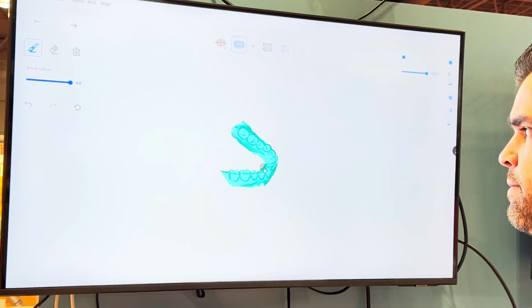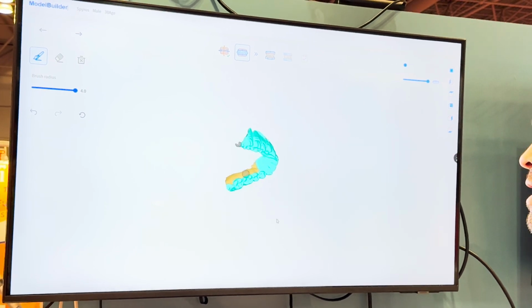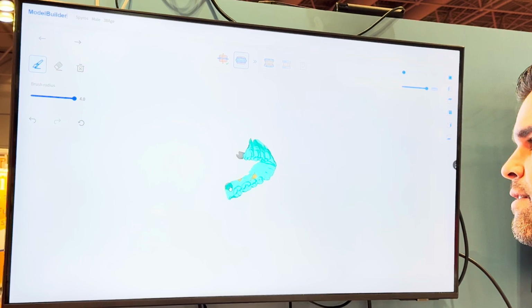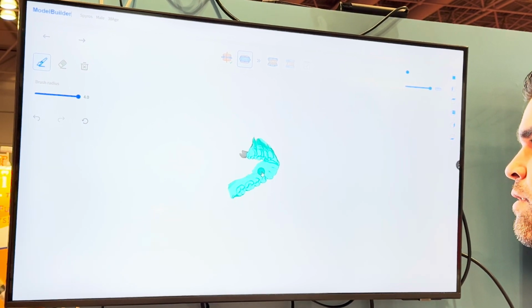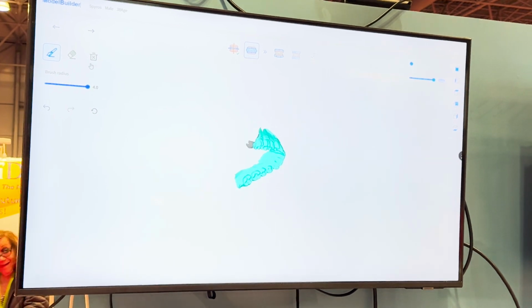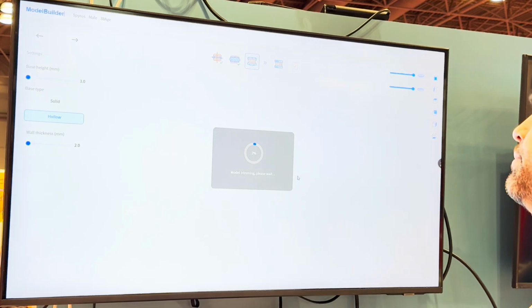So, as I said before, in case you need less data for some reason and you already have what you need, you can even include less area. It's not necessary to cover all the area that you have here. So, once we're done, we click Next, Confirm.